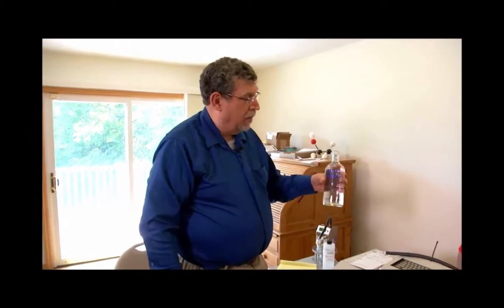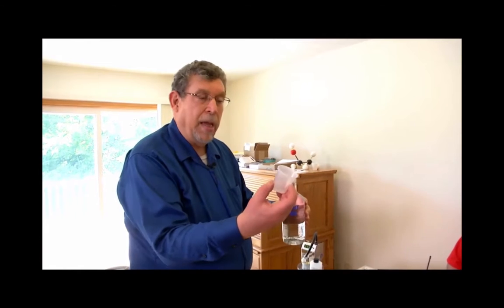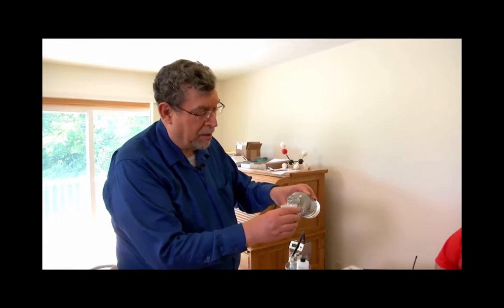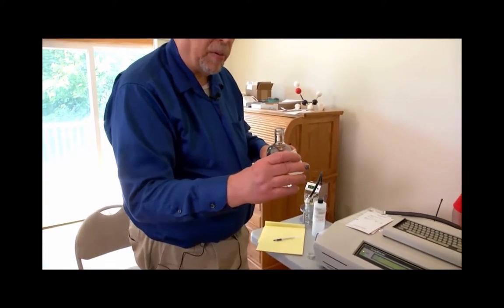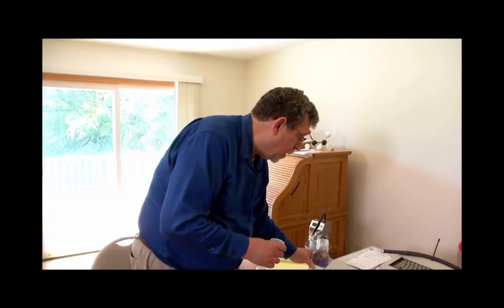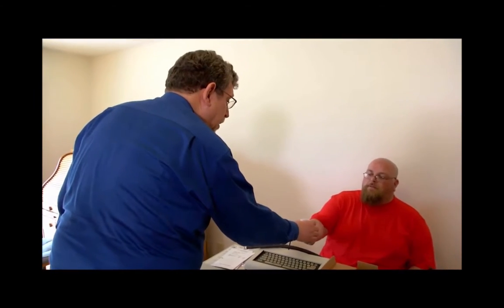So here we go. We do another one, and this is where you get too much. You have a bottle of Absolut vodka, 80 proof, 40% alcohol by volume. Have a little disposable plastic cup. I'm going to pour just a little bit, probably about a quarter of an ounce or so, and have you then swish your mouth with that. Don't swallow. And then spit it back into the cup.